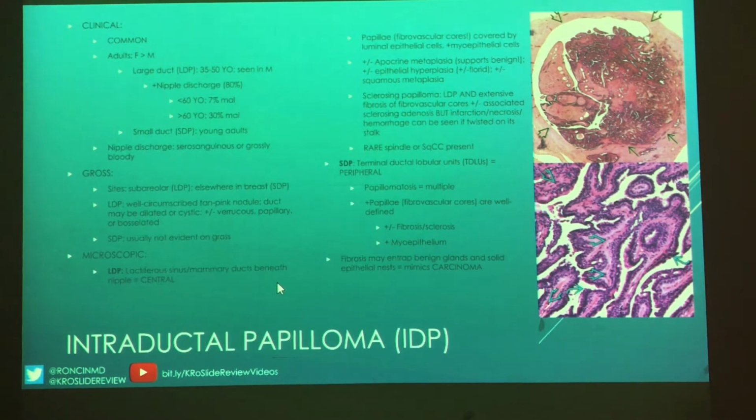And SDP is also slightly notorious for having entrapped epithelial nests. What happens is when they go in with the needle to take the biopsy, they track epithelium back. So when you get the excision, it can be really scary because you're like, I have a biopsy site and I have some epithelium that's just kind of floating in the breeze. Is that carcinoma or not? That also came up on the pre-read. Yeah, because it's a scary thing.